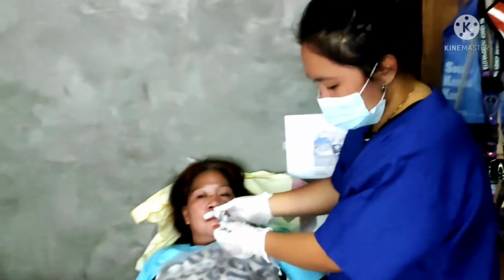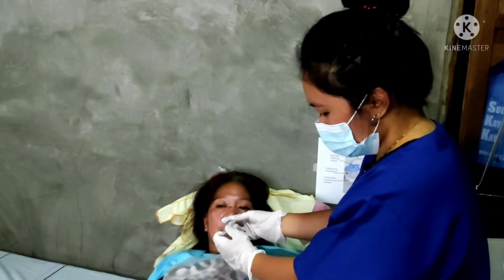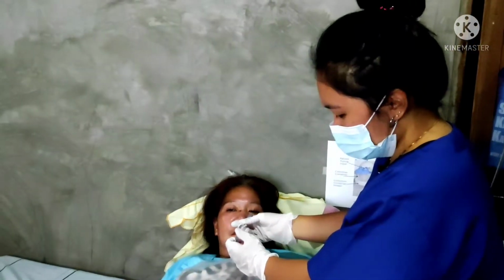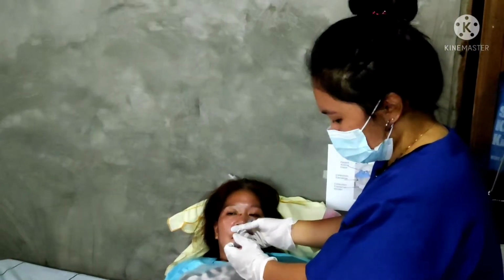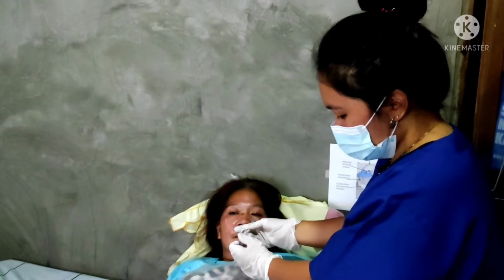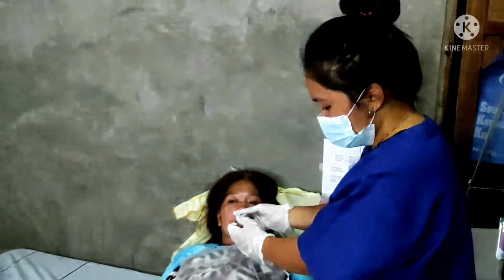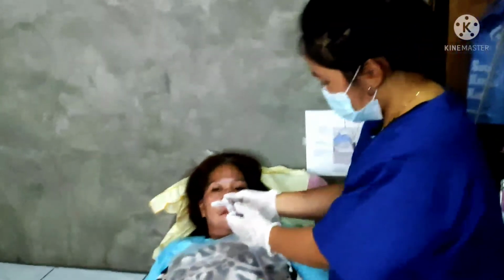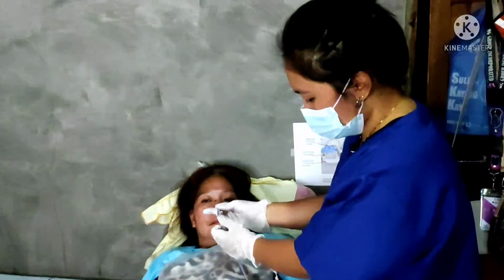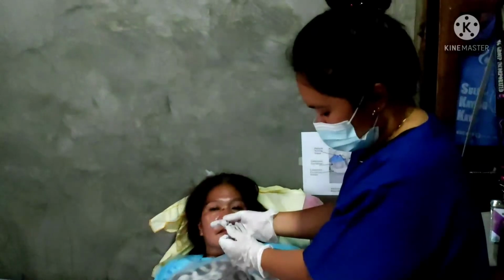As you insert the catheter, do not cover the catheter vent. Follow the natural course of the nares. Orient the catheter downwards slightly. Don't force it. If you feel resistance, you probably hit the carina. In that case, withdraw the catheter 1 to 2 cm, between 0.4 and 0.8 inches, before applying suction.